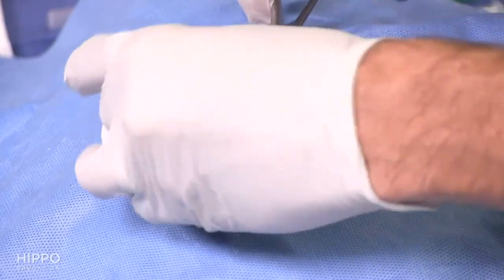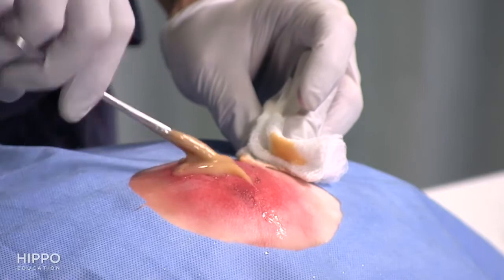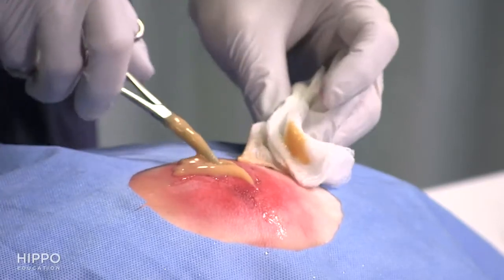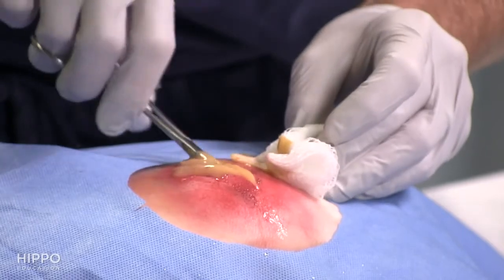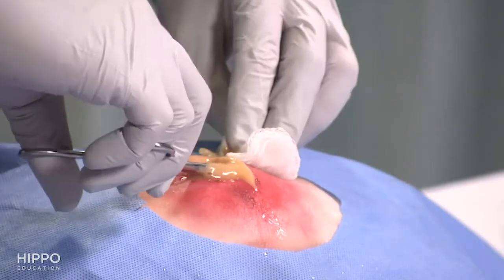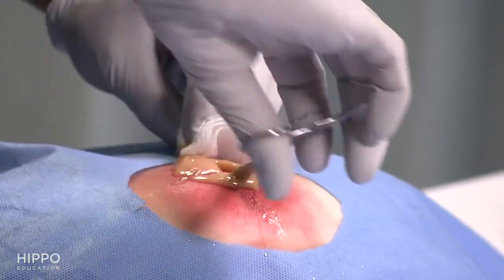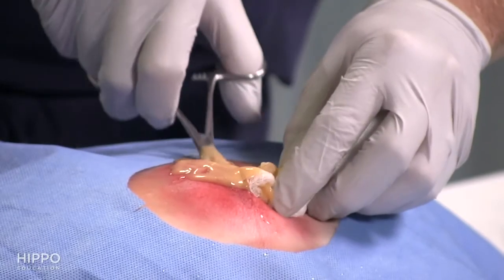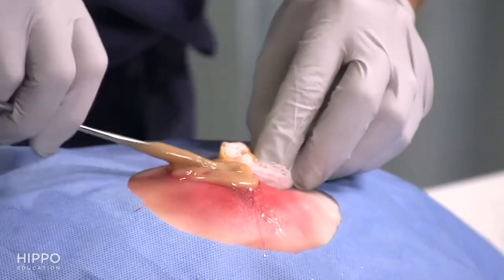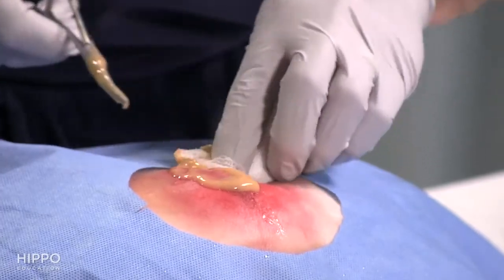And using the 4x4 to kind of clean up and pick up that pus so it's not running down all over the place is just kind of a style point. But again, these can be messy. These can pop out and shoot at you, so that's why the eye protection is important. Getting it on the walls, just make sure you clean it up at the end. And you open that up and try to get all those areas, all those pockets of pus until you don't have any pockets left in there and you're sure that you've really explored and opened up the entire abscess.